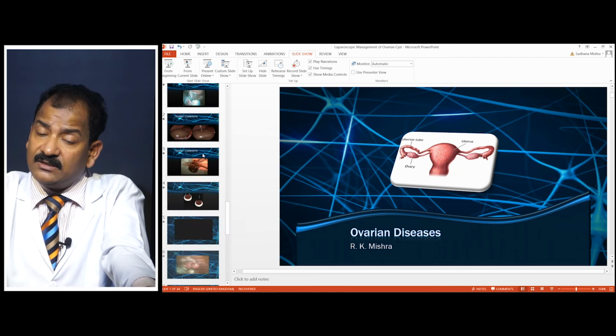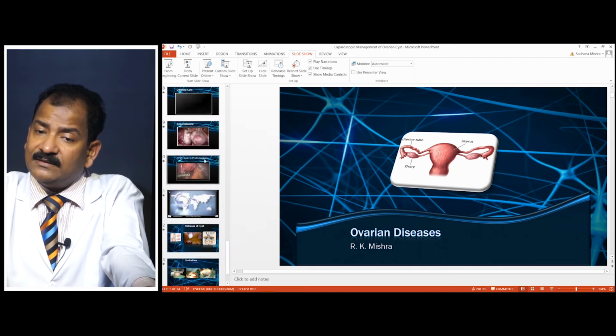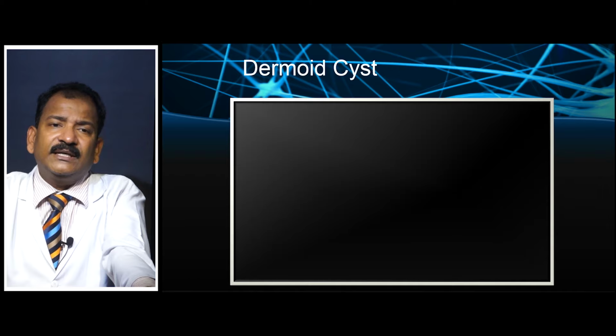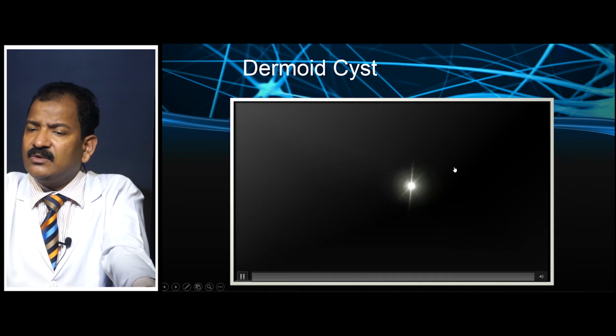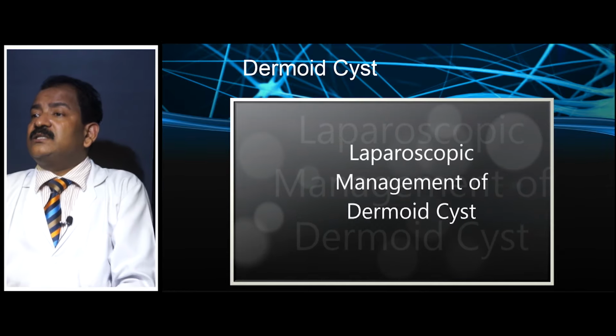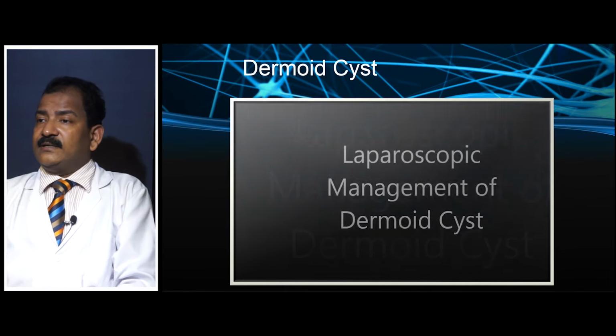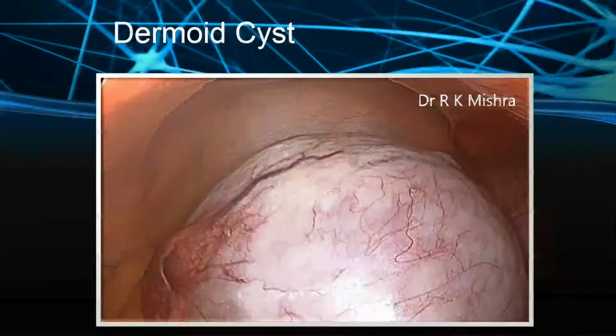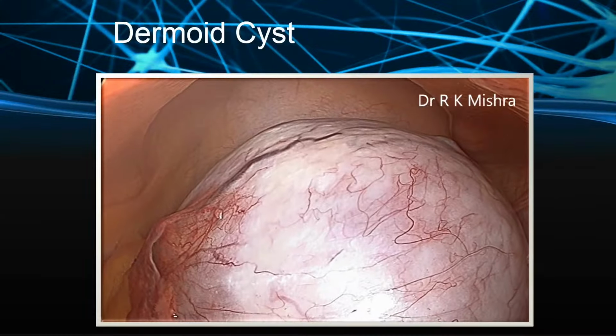So, the patient ideally has to be explained this, and then you do it. This is a debatable topic actually, but in laparoscopy it is not contraindicated just due to fear. People are doing it, and thousands of dermoids are removed every day by laparoscopy.